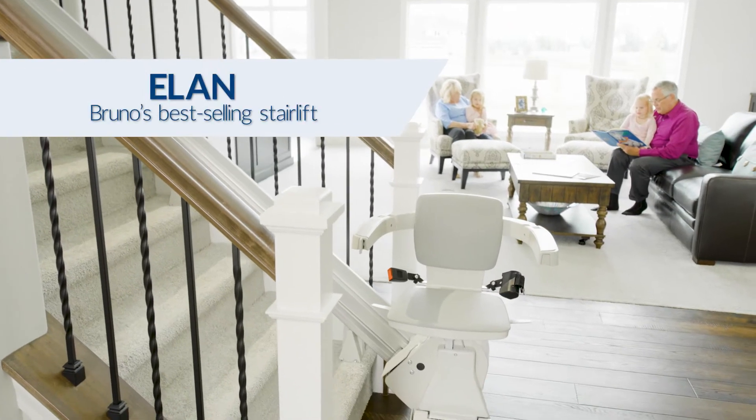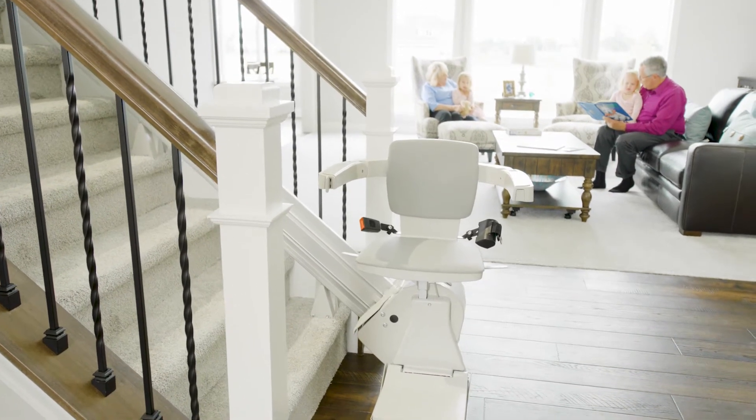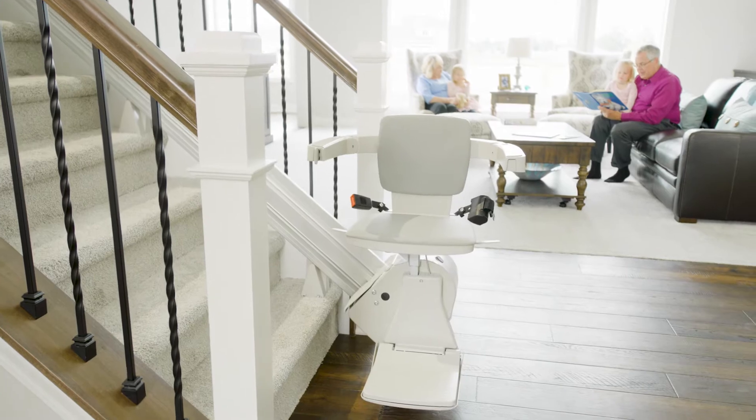Home is where the heart is. The heart of family. The heart of memories. Let a Bruno Elan stairlift help you stay in the home you love.